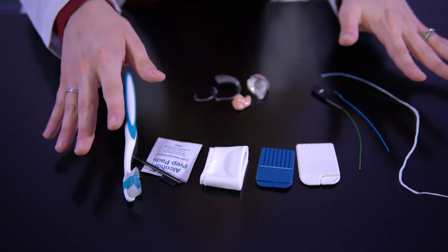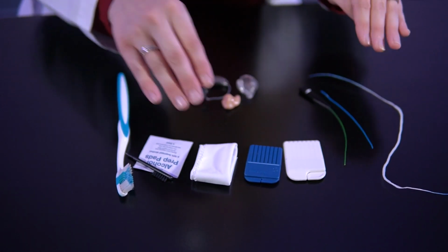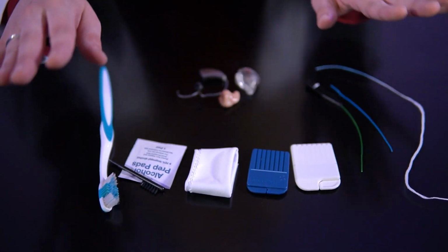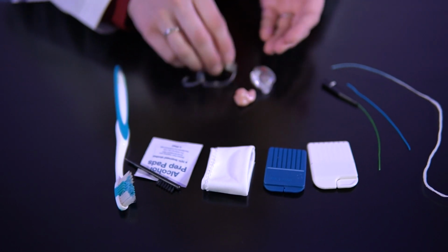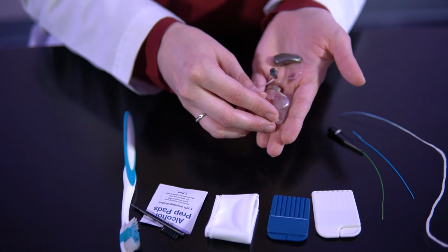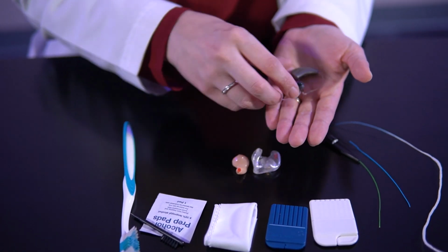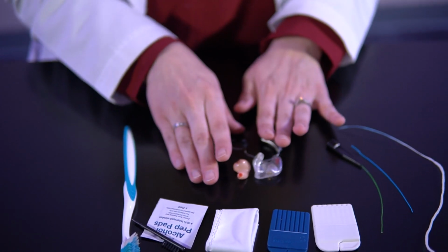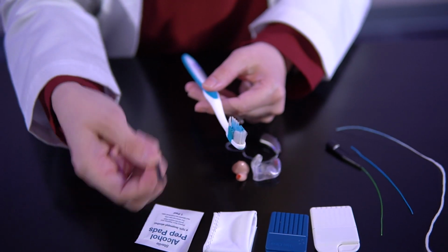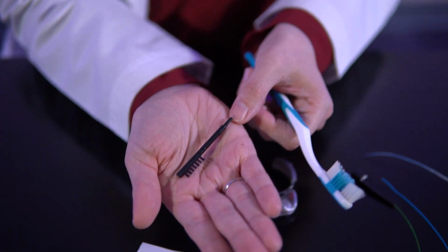Okay, so here I've got everything that you're gonna need to clean your hearing aids. Now you're not gonna need every single thing of this, but what you've got at home will work, okay? I have a couple of different types of hearing aids here. This may not be the type of hearing aid that you have at home, but the cleaning process is still gonna be about the same, okay? So I've got my hearing aids. I also have a good old toothbrush, but when you get your hearing aids, most of the time you do get this little kind of black brush with this little loop on it.